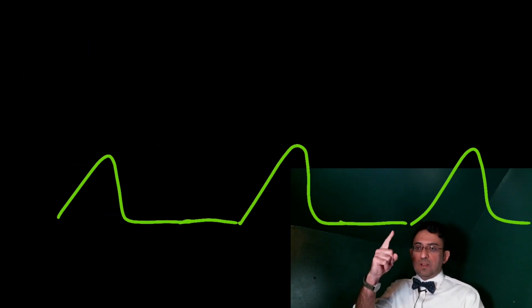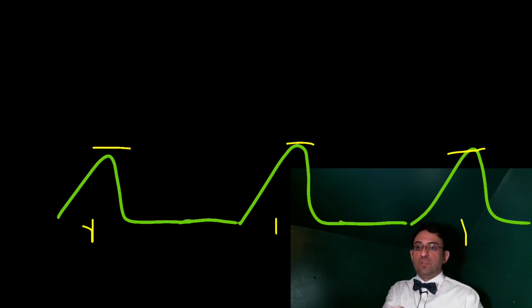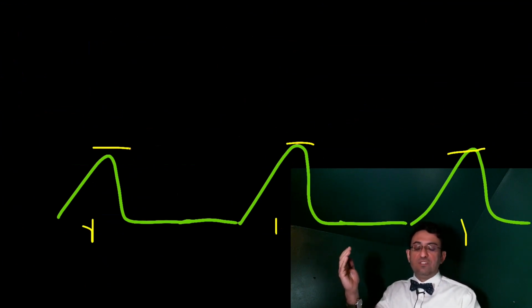Now, if you see something like this, this is the typical shape of controlled ventilation. The patient only breathes when there is an impulse from the machine at set points, and you can see very regular intervals and very regular amplitude for the peak pressures that are reached. There are no differences between the waves in terms of intervals or amplitude. So everything is controlled by the machine. This is usually the patient who is unconscious and intubated. And this is an example of a controlled mode.